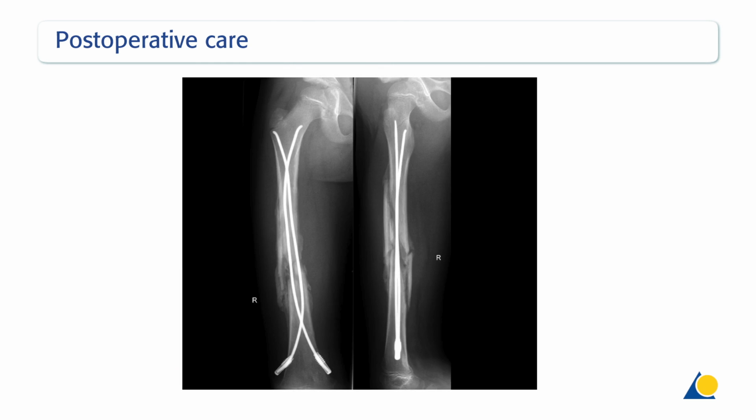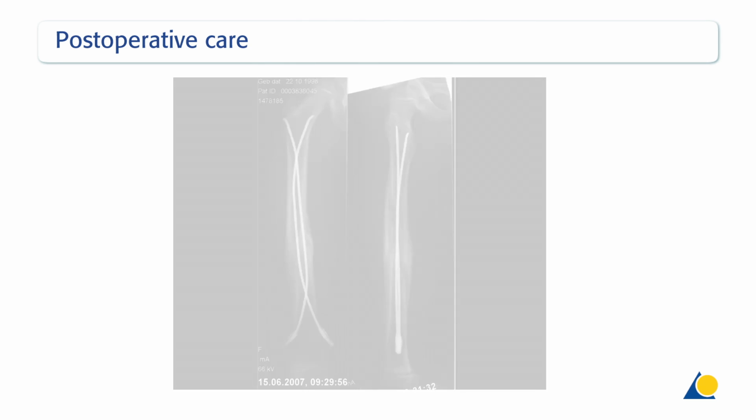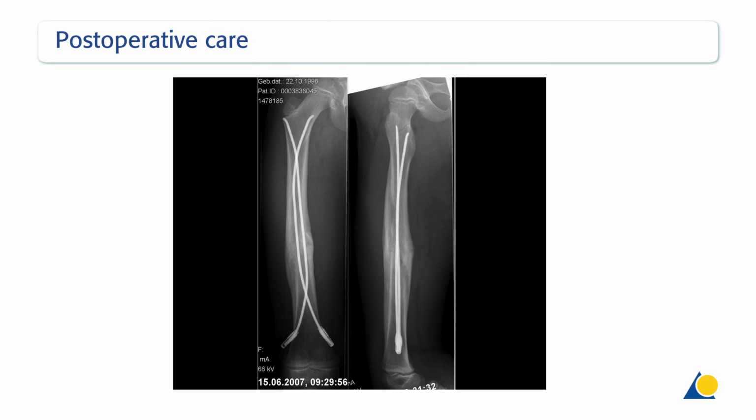The first clinical and radiological checks are usually performed 4 to 5 weeks postoperatively. Full weight bearing may be started depending on the callus formation. Normal activities and school sport can usually be resumed after 6 to 8 weeks. Clinically, bone healing is verified with X-rays after 4 to 6 months, and nail removal can usually be scheduled after 6 to 8 months. As bone healing varies from age to age, there is no recommendation for nail removal after a specific number of months.